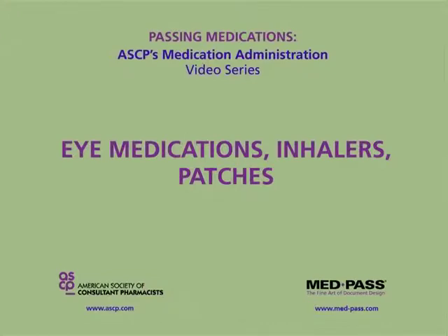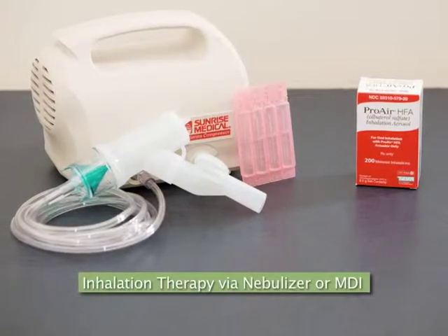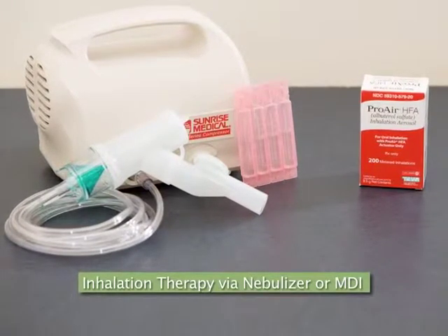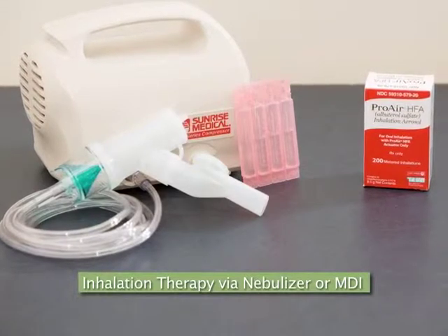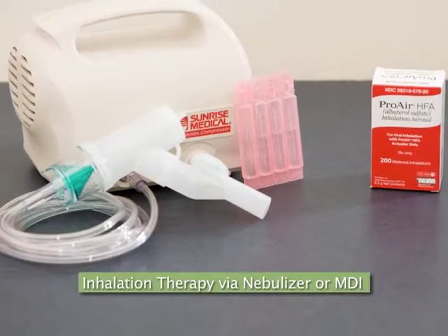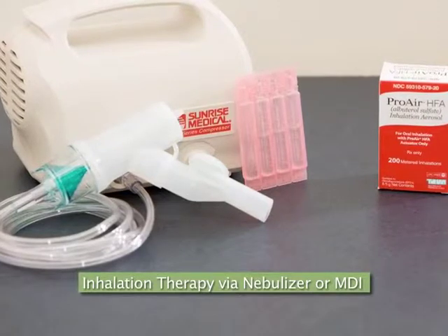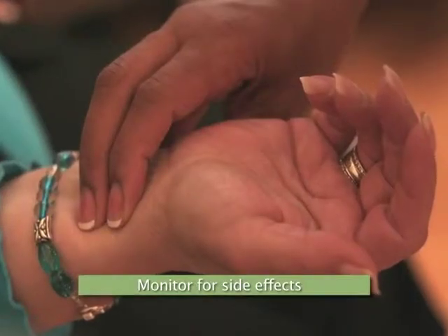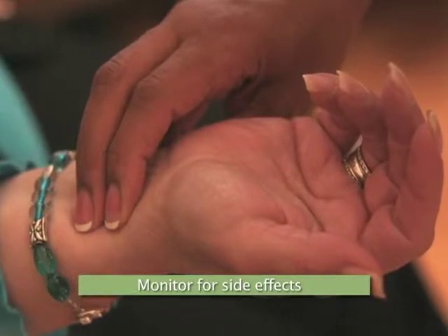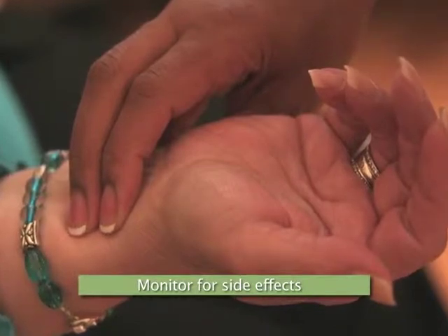In the next 15 minutes, we will review the correct technique for the administration of oral inhalers, eye drops and ointments, and transdermal patches. Oral inhalation therapy is used to treat respiratory conditions, such as COPD and asthma. Inhalation therapy can be administered using a metered dose inhaler, also known as an MDI, or using a nebulizer machine. Common side effects associated with oral inhalation therapy include increased heart rate and nervousness. It is important to monitor for these side effects after administration.